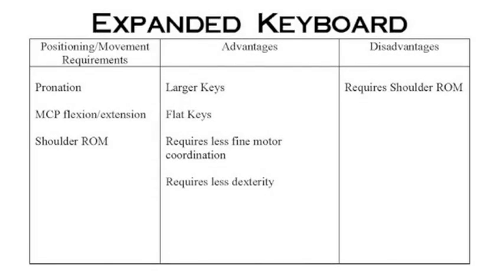Positioning and movement requirements for the expanded keyboard are pronation, MCP flexion extension, and shoulder range of motion. Advantages of the expanded keyboard are that it has larger and flat keys, requires less fine motor coordination, and requires less finger dexterity. Disadvantages of the expanded keyboards are that it requires shoulder range of motion.